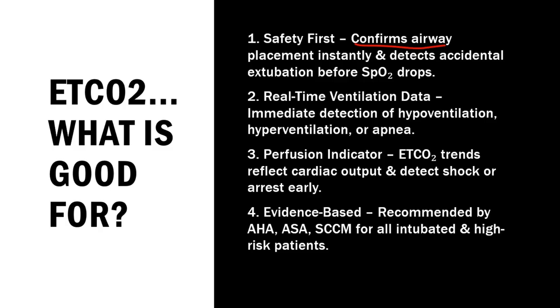So end tidal CO2, we're about to start using it for conscious sedation, but hopefully in the near future we'll start using it for more of our intubated patients and more of our lethargic level of conscious patients, because it can tell you how well a person is keeping up with their metabolic demand and if a person needs to be intubated minutes before a SpO2 detector will.